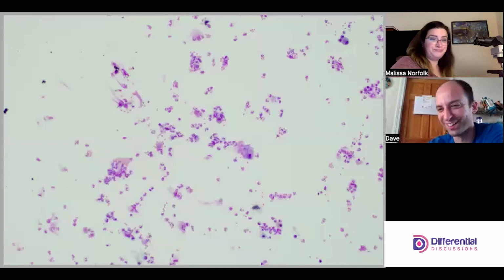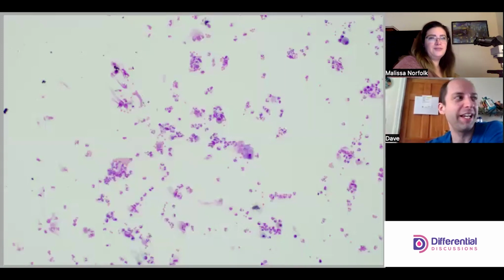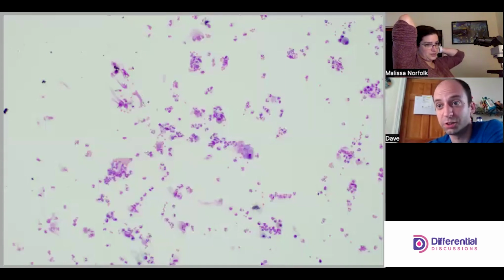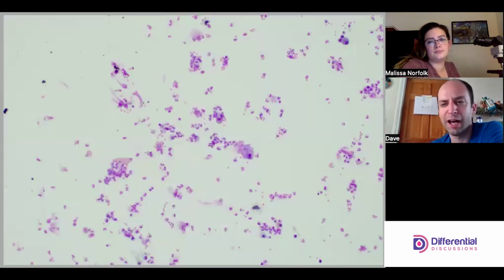My favorite. So, BAL, bronchial alveolar lavage. Right? So this is the first body fluid that's not a body fluid.